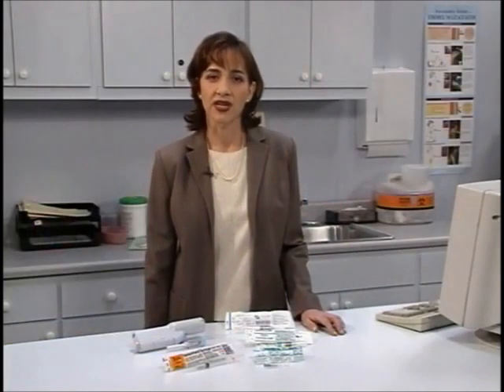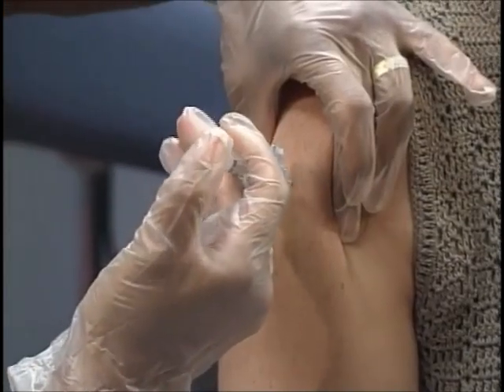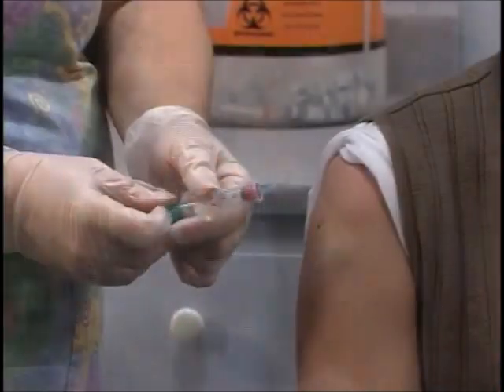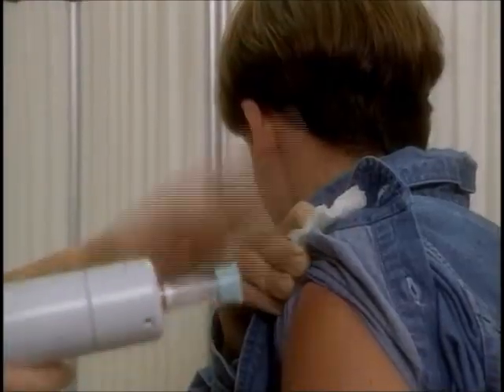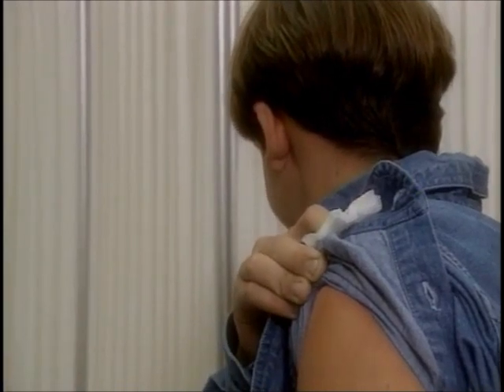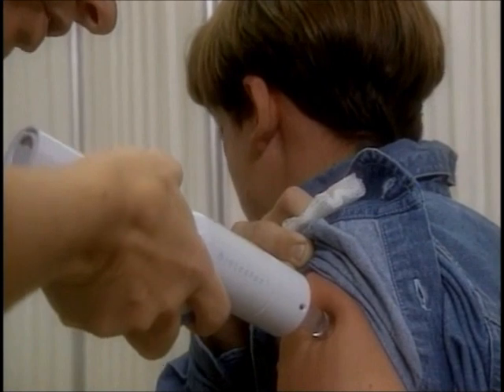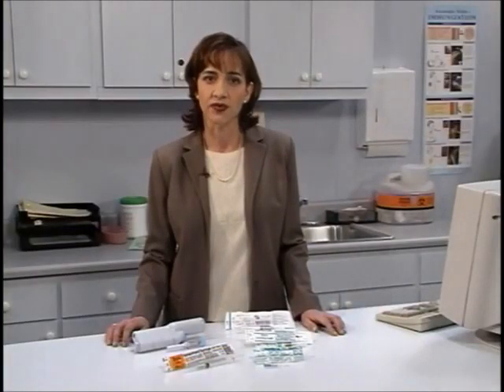Now let's talk about your safety. All of the syringes you see in this video are safety-engineered sharps devices. They have been designed and manufactured in recent years to protect healthcare workers from needle stick injuries. There are a number of different styles and brands on the market. There are also needle-free systems now, and as you probably have heard, researchers are even developing edible vaccines, skin patches, and aerosols. But the needle injection will continue to be the most common method for some time.